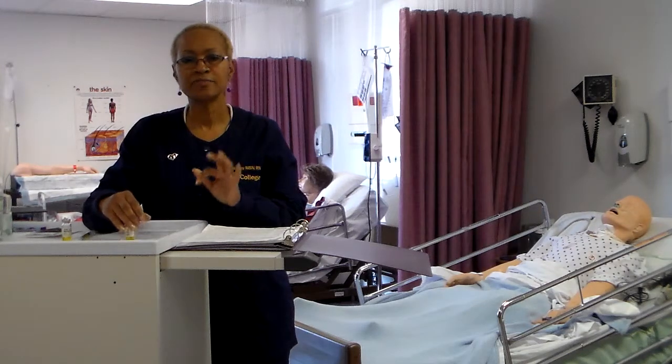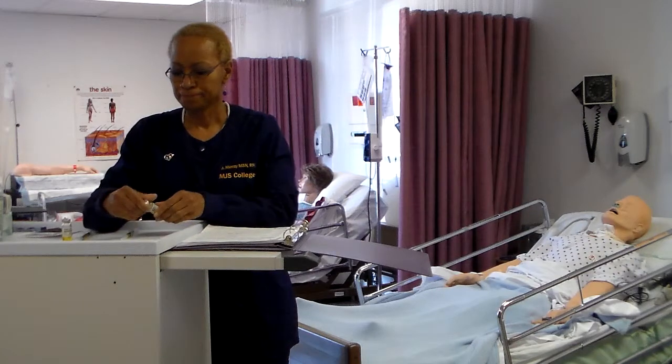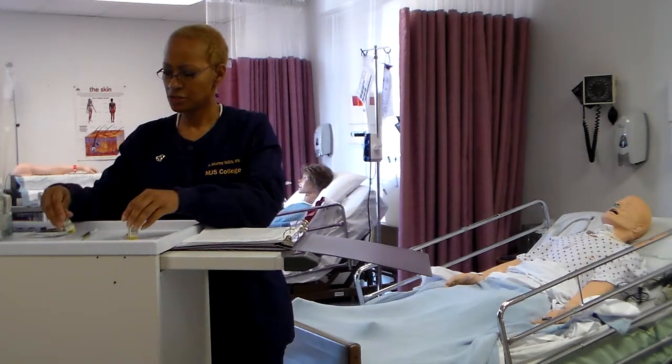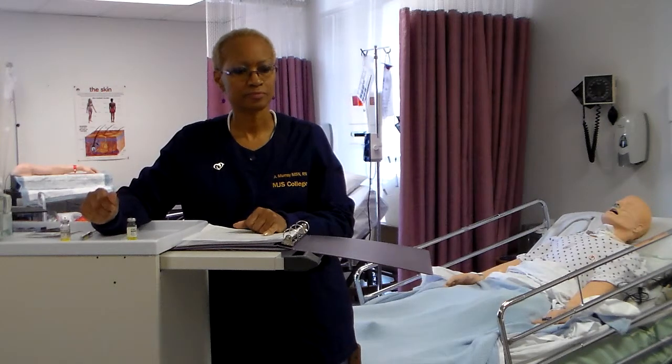You're going to be using the medication that you just prepared for the previous procedure. So all of your vials are correct. Observe verbal and nonverbal responses toward receiving injection.